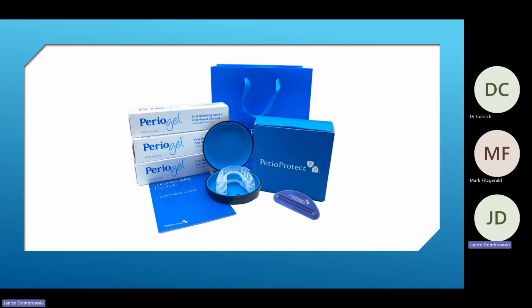So this is what it all looks like when you get it back from the lab. You have your trays, and you have the case to put the trays in. You have the tube squeeze. You have the home care instructions, because no matter how many times we tell them to do things chairside, they forget.